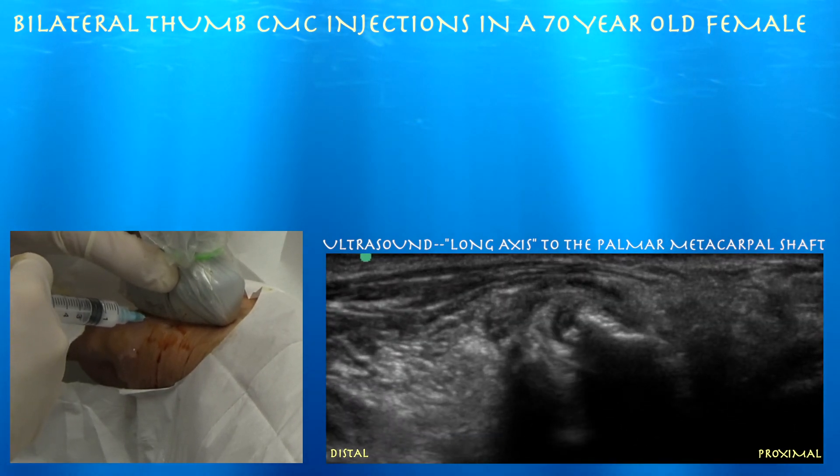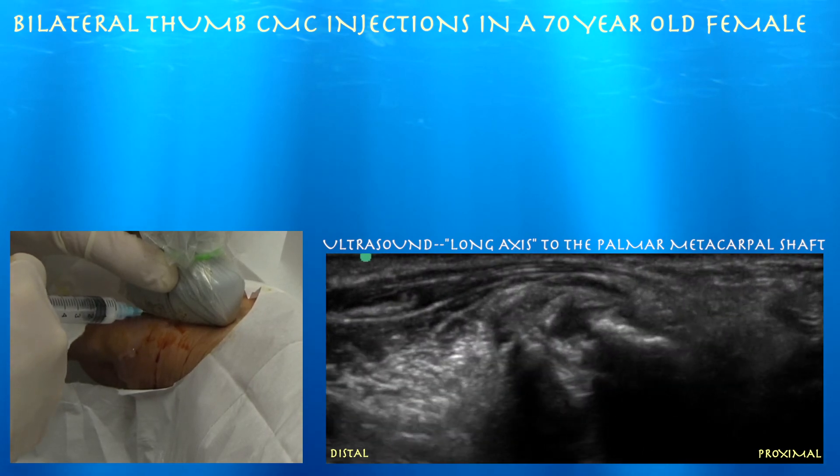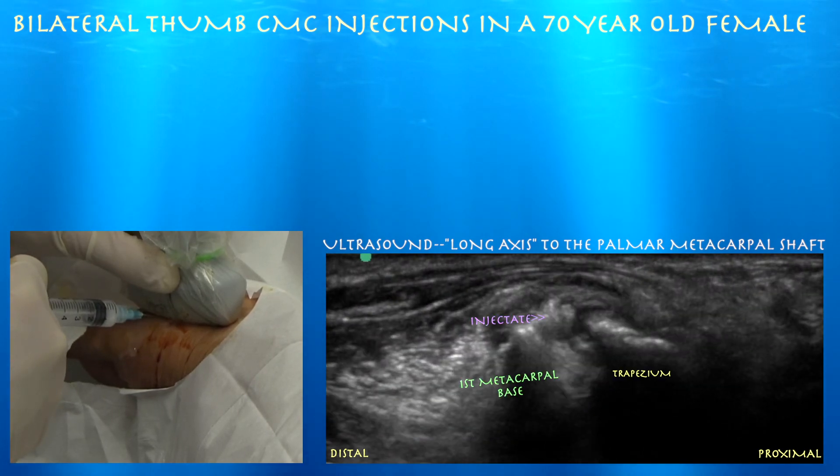Here's some of the injectate going within the joint — you can see how it's distending the capsule and spreading on both sides of the joint.